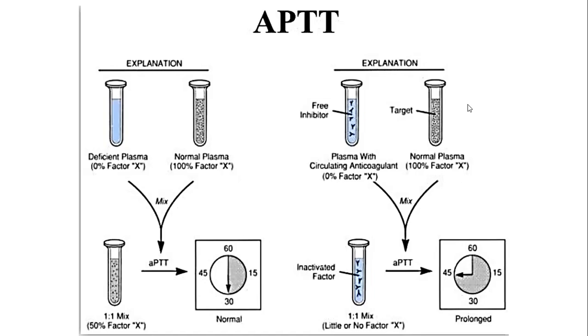But, if may inhibitor ang test sample or ang sample ng pasyente, pag mix mo ni sang control kag test sample sang pasyente, ang iya APTT result will be prolonged. So parehas ni sa natabo sa picture, no? We mix the two samples. The first one, which has an inhibitor against clotting factor 10, and the other plasma contains clotting factor 10.